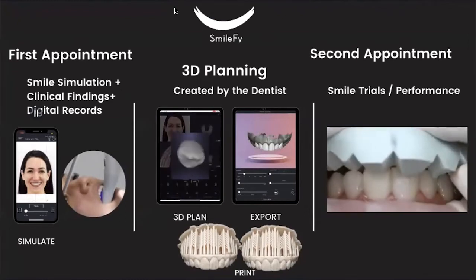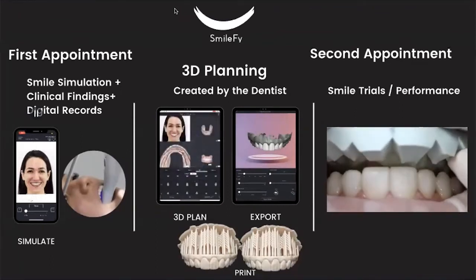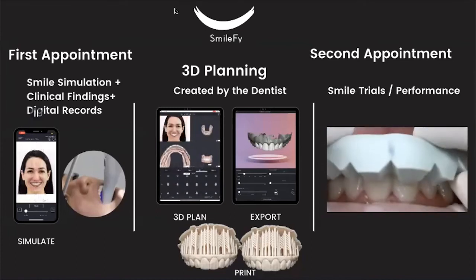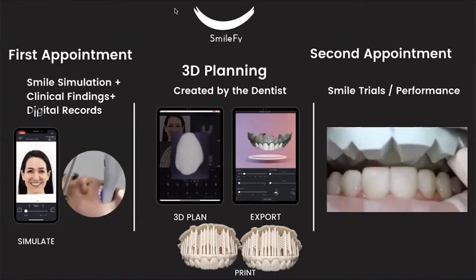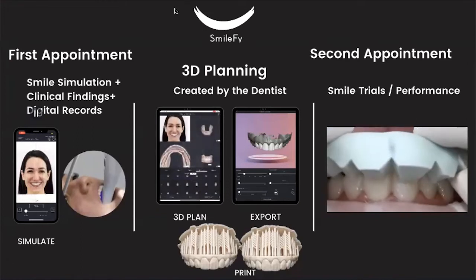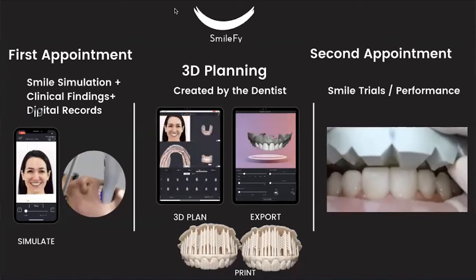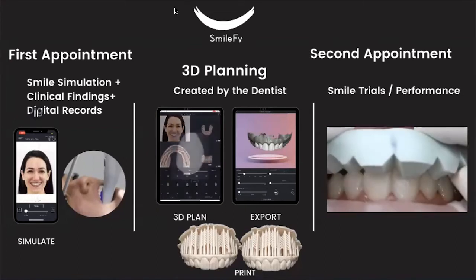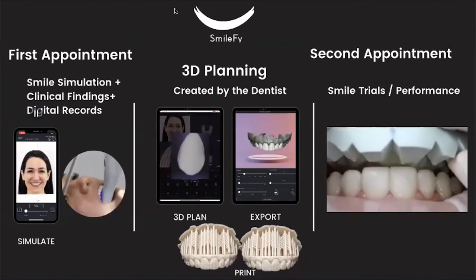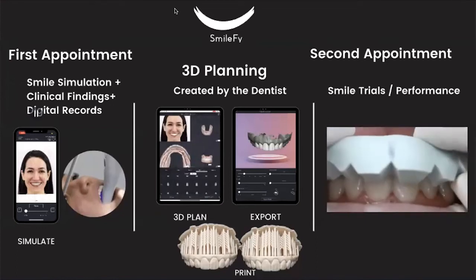So we are going to go over the first appointment where we do our clinical exam, digital records, and how we communicate with our patients through smile simulations. Then we're going to go into the inter-appointment, which is where we create our 3D facially guided dental wax-ups. And then we're going to finalize this webinar today with the second appointment, which is performing the smile trials. How long does it take to show the patient two types of digital wax-ups, and how to make them get the best out of these treatment plans?